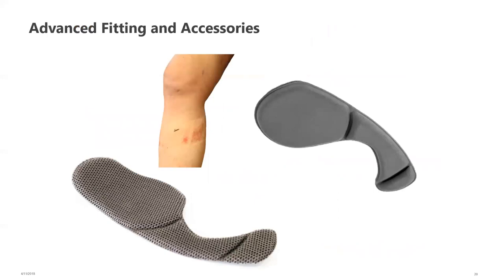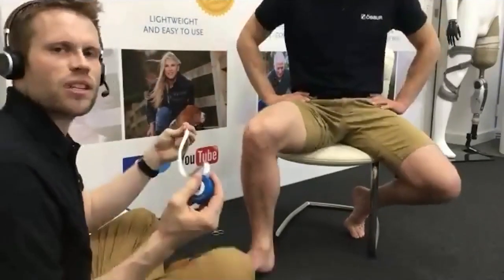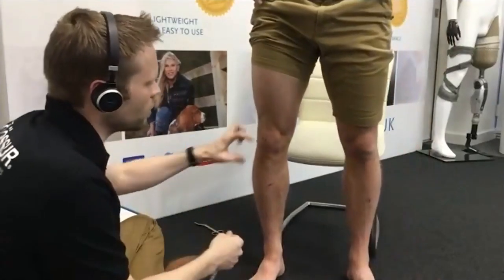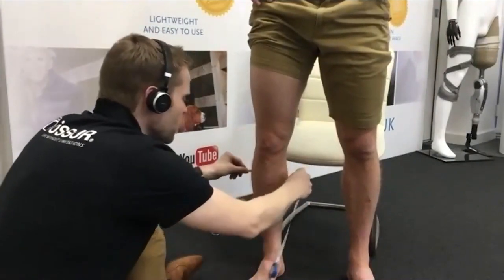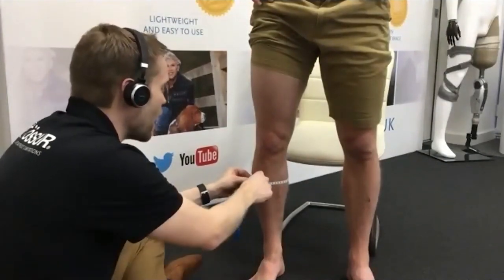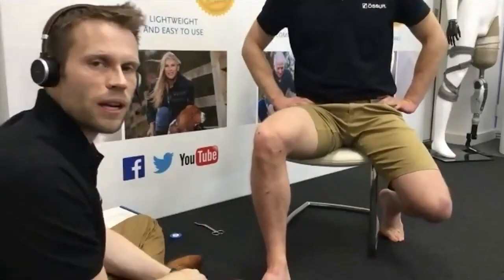Now, advanced unloader fitting and accessories. Starting with a standard fitting: with the leg straight, we find mid-patella and place the tape measure at the centre, passing it down 15 centimetres below mid-patella and measuring the circumference. In Pete's case, this comes in at about 38. We then compare this to a sizing chart and fit the correct brace. There are lateral versions as well as medial versions; in Pete's case he has a medial compartment issue.